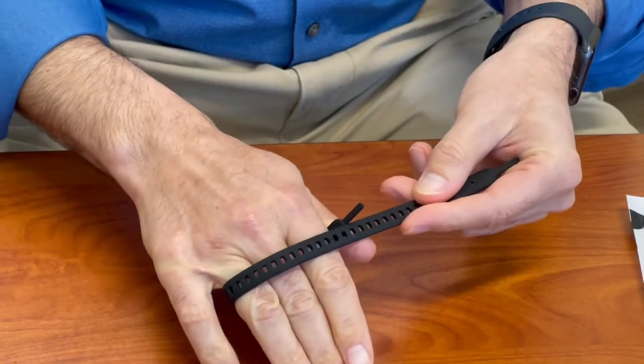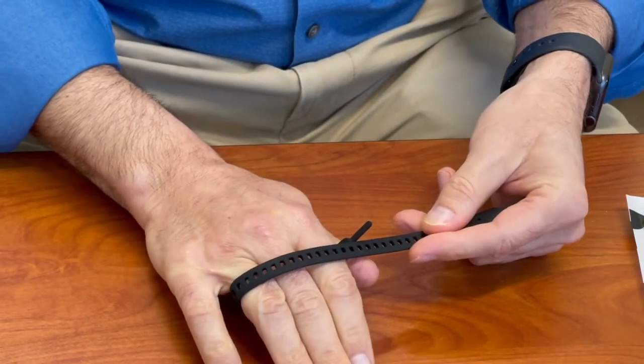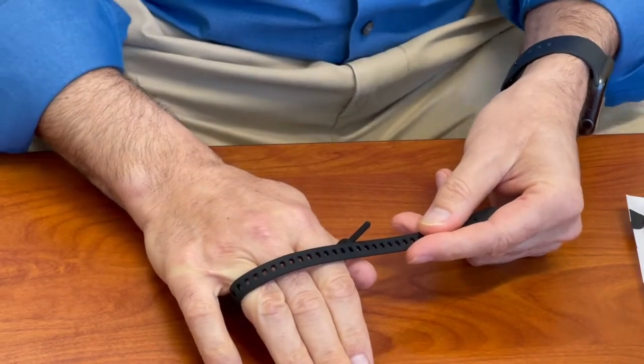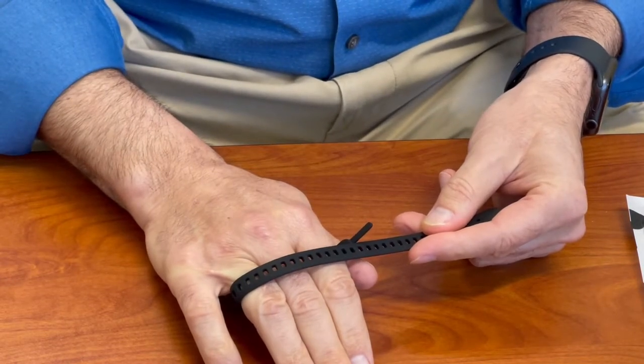First, the splint is wrapped around the fingers. In this case we're going to do a middle finger relative motion orthosis in extension.